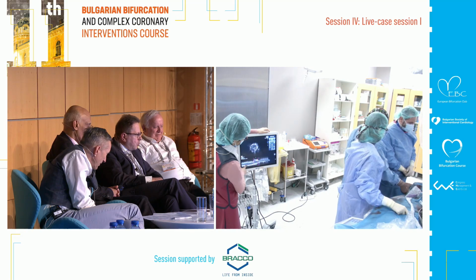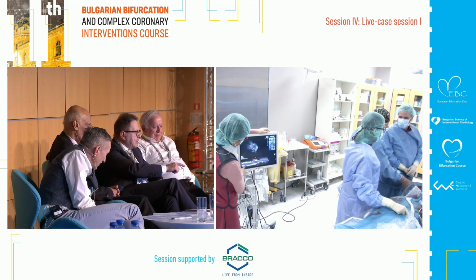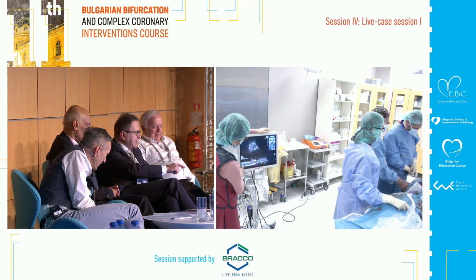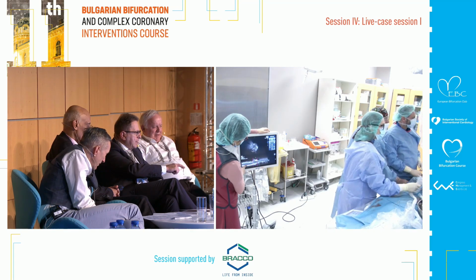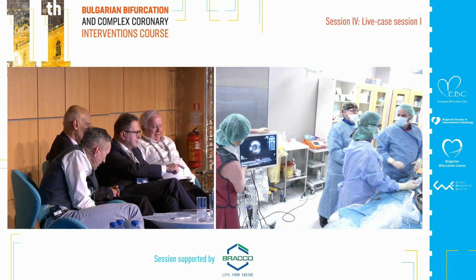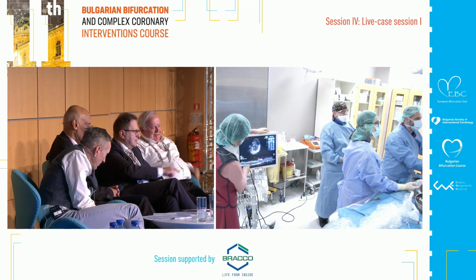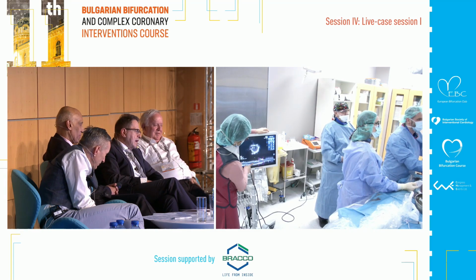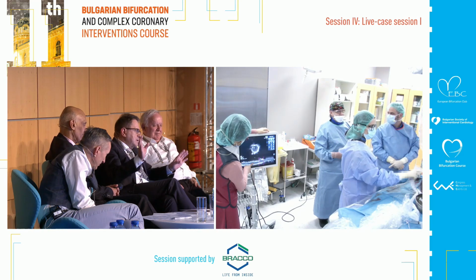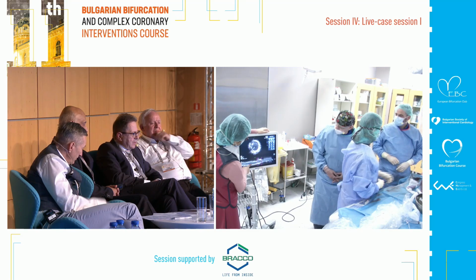Sorry. Just go back a little bit, because that was the point. Slowly, back. The reason is that we use it. You see, that's the circumflex. So, in my opinion, I think this is a very good result, of course, but still I would say that the left main is 4.